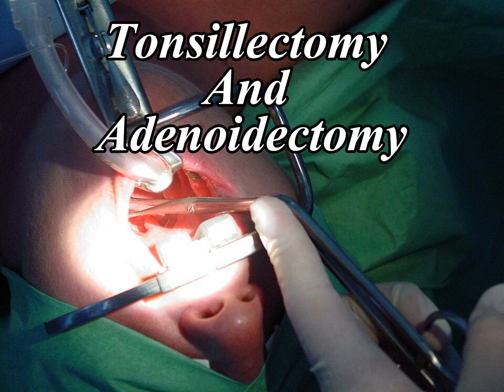Once freed, the tonsil is removed, and bleeding points are controlled with electrocautery, suction coagulator, or hemostatic agents and sutures in selected cases. The same process is repeated on the contralateral side.